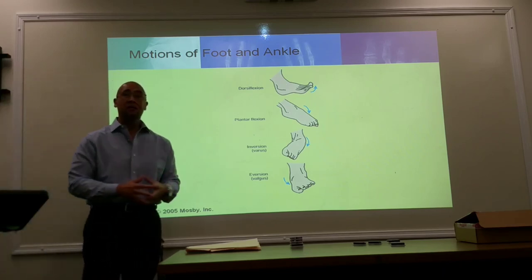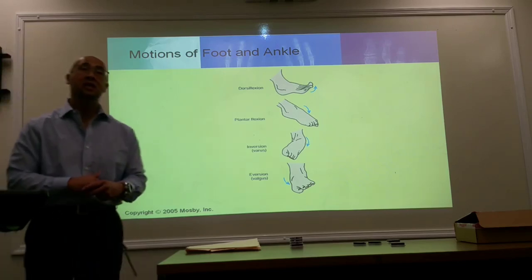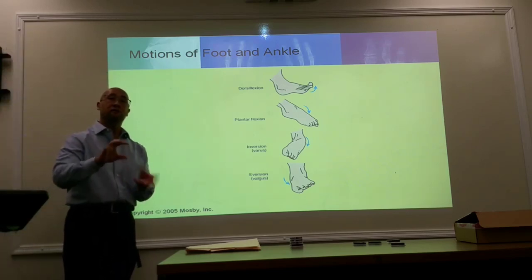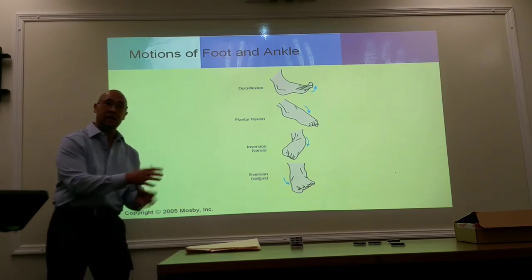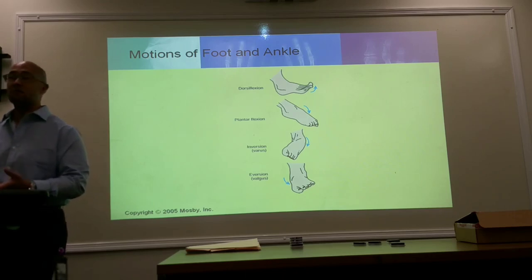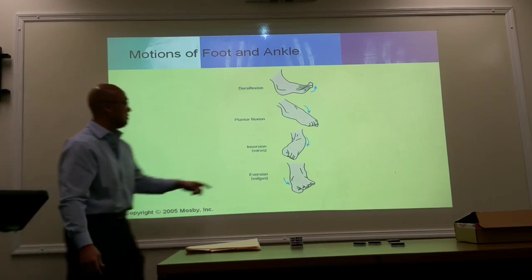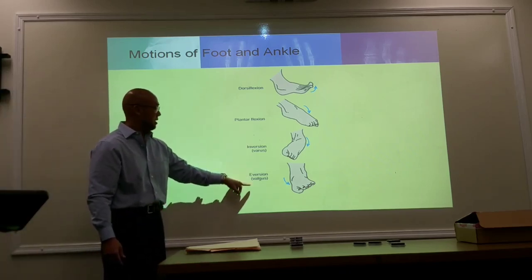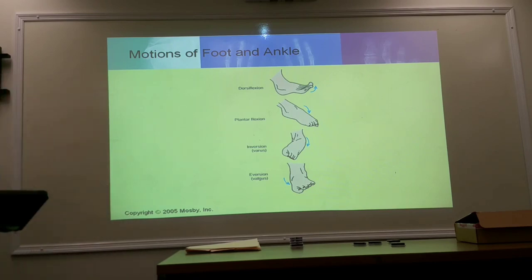Now, in some ankle studies, we will do stress tests where we will purposely and deliberately turn the foot either towards the middle for inversion or towards the outside for eversion. Okay, inversion and eversion, or Latin terms, varus and valgus. Varus and valgus.